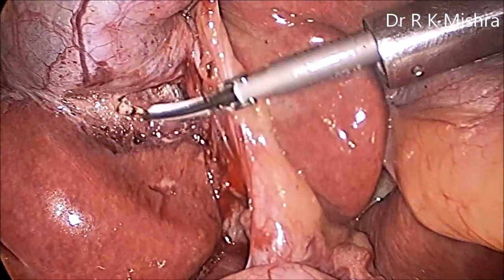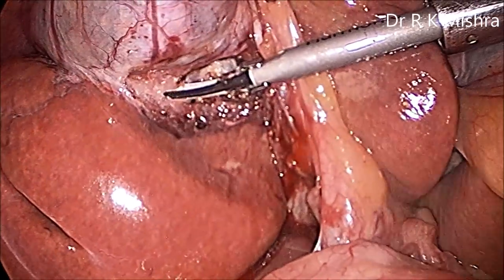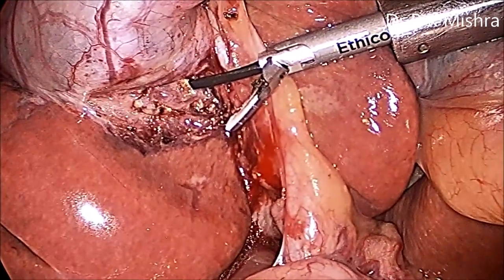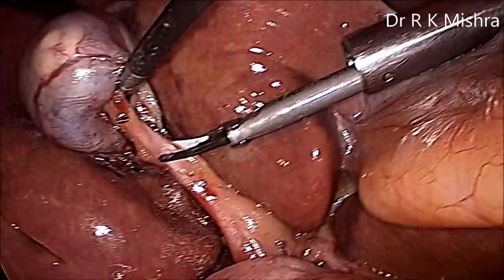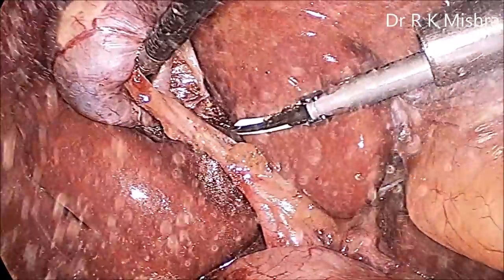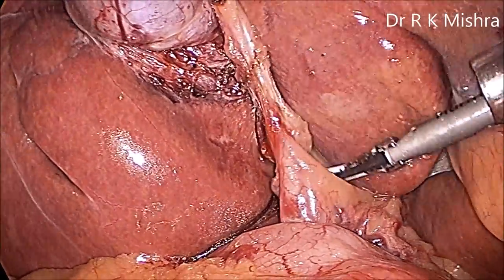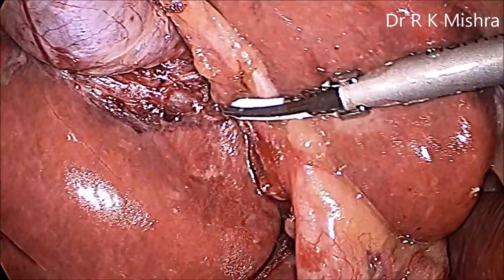The inferior surface of the liver is one of the landmarks of Calot's triangle in laparoscopy. You can separate the body of the gallbladder from the inferior surface of the liver, and then go for stripping of the peritoneum of the cystic pedicle. This posterior window is enlarged — just strip the peritoneum of the pedicle holding only the peritoneum, and once you strip it you can push the CBD down. One of the big mistakes surgeons make is dissecting below the Rouviere's sulcus.